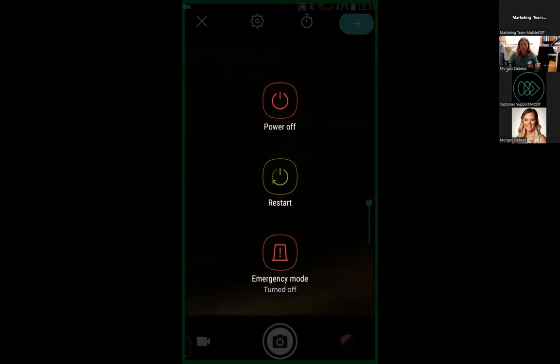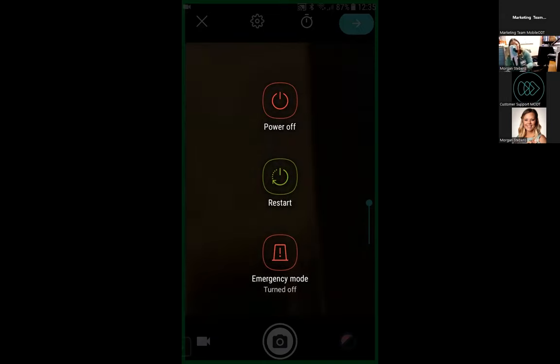Oh, I did that kind of off screen. I apologize. I transferred it into the colposcope. So that's not what I wanted to do. So now you see it's not turned upside down. Then you can see that I just tapped the screen and I can zoom. The zoom is on the right, up and out, okay? I always bring it all the way out before I zoom in.